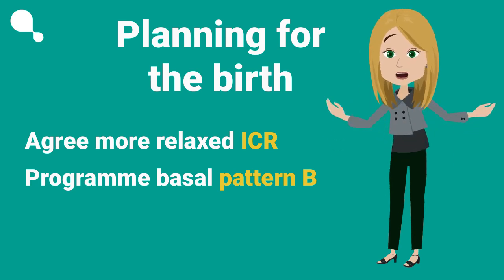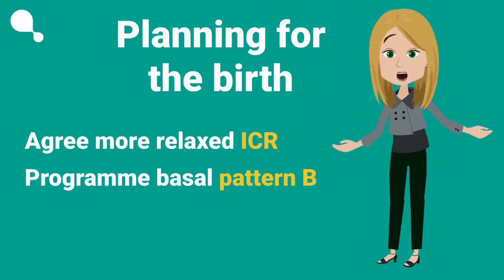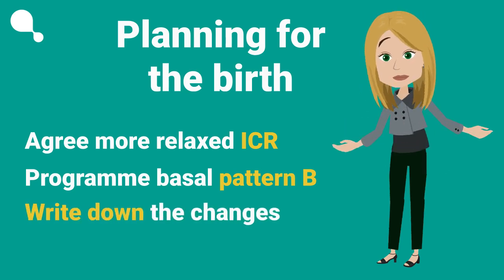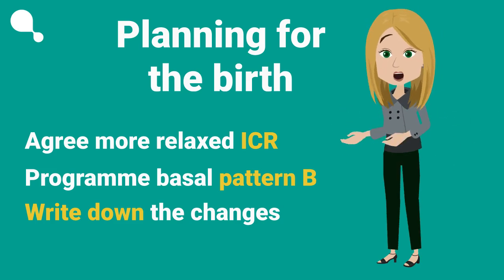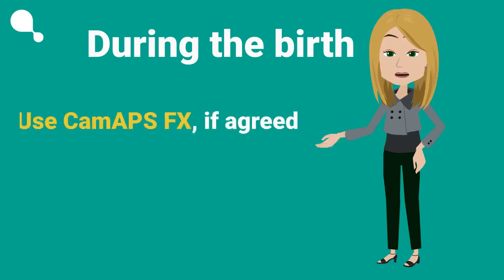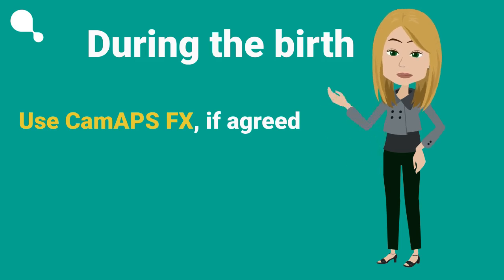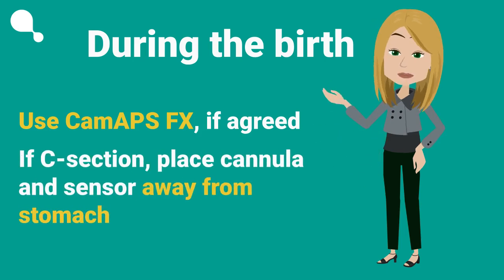Pattern A's basal rate would have been increased throughout the pregnancy as a safety net, in case CamAPS FX couldn't work. Only swap to pattern B on the pump when the baby is born. All these changes should be written down in your medical notes, and you should also have a copy. During the birth, CamAPS FX can continue to manage insulin delivery, if agreed with your healthcare team. If a C-section is planned, please make sure you place your cannula and sensor away from your stomach.